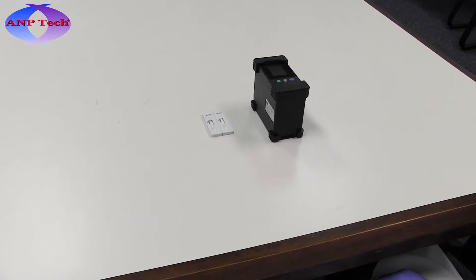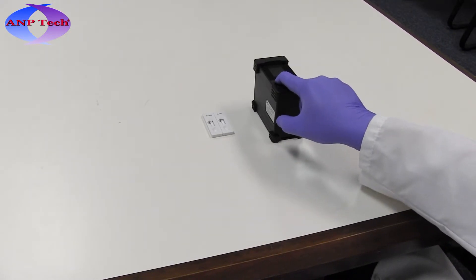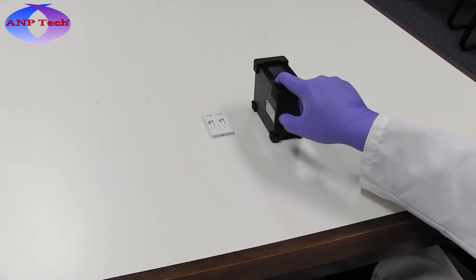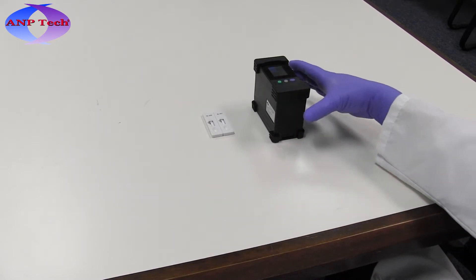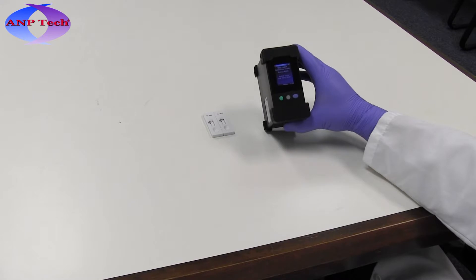To read the results with the SAR-4 standalone reader, turn on the reader by pressing the green power button for 5 seconds until the home screen is displayed. When the home screen is displayed, the reader is ready for use.